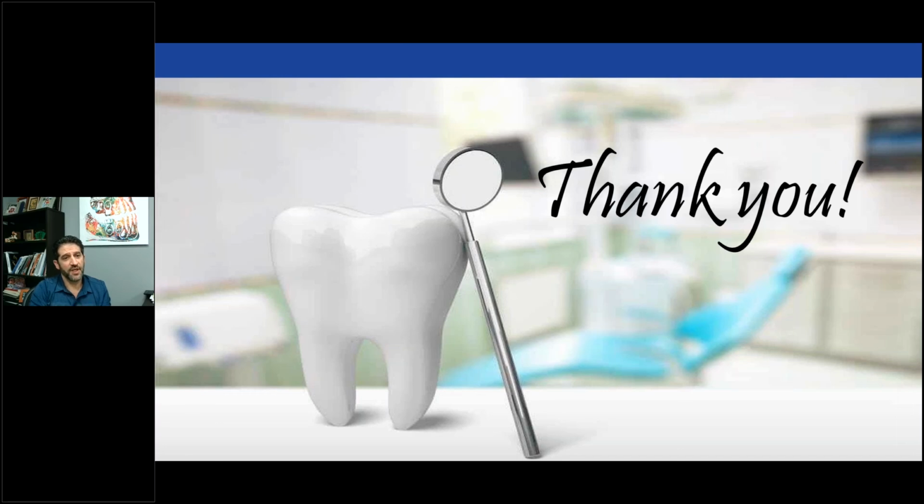We took an anterior crown design, and we took a design of a molar, just out of our files of something we already did. We milled each one of them 3 times. And then we sintered them on 3 different programs. So we took the one anterior and one posterior crown, and we put them in one program. The next day, during the day, we did the other program on 2 others, and the next day after that.